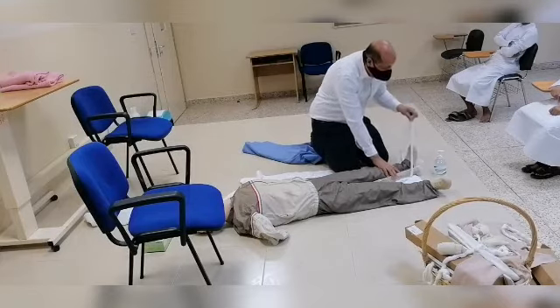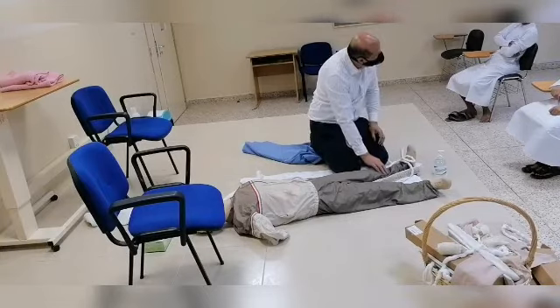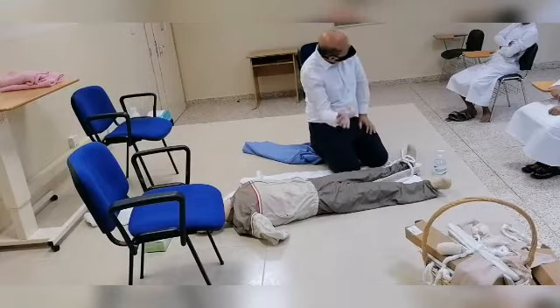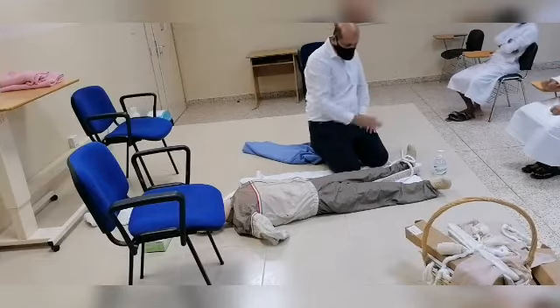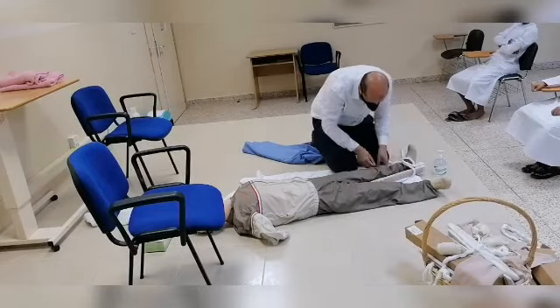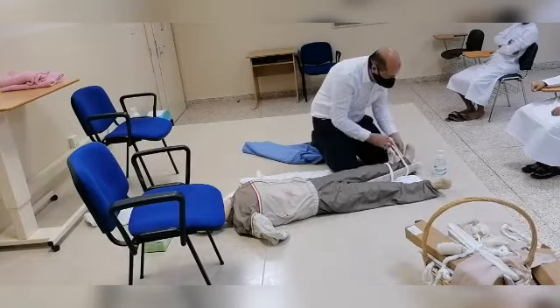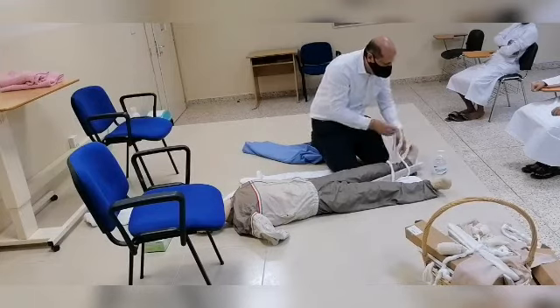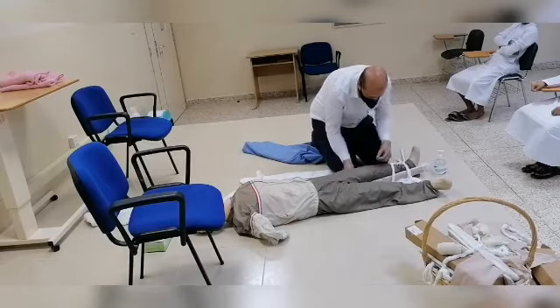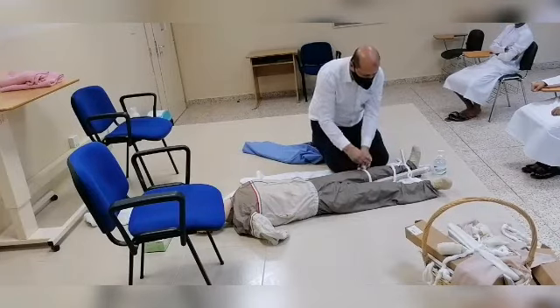We have to be aware not to put any binder directly over the site of the fracture itself — it has to be above and below it. So we are using four binders here. I will fix this one with just a temporary knot, and I will fix the first one above the knee, also just a temporary knot.